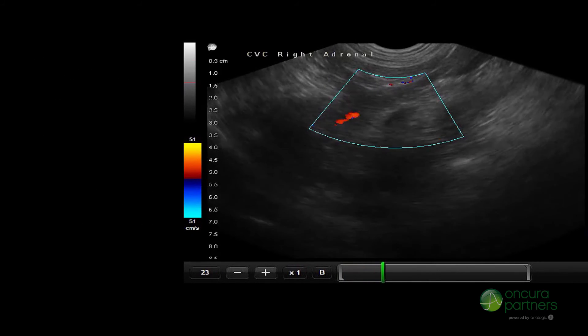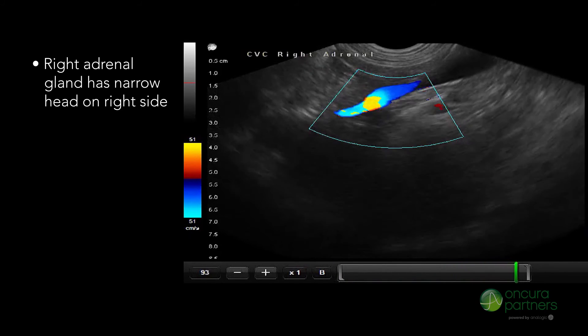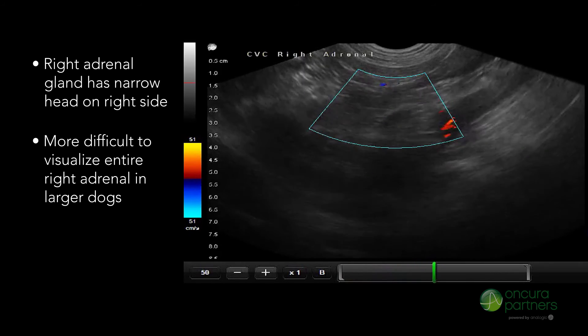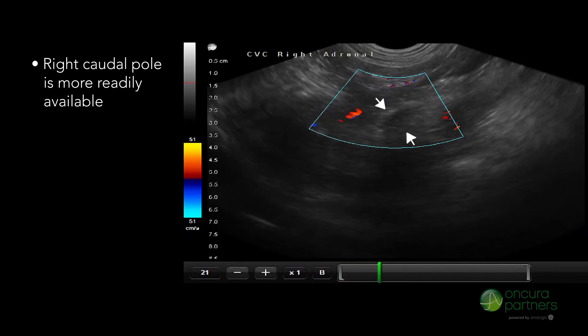On the right side, the right adrenal gland has a narrow head. It should be noted that in larger dogs, it would be difficult to visualize the entire right adrenal. Usually the right caudal pole of the adrenal is more readily available.